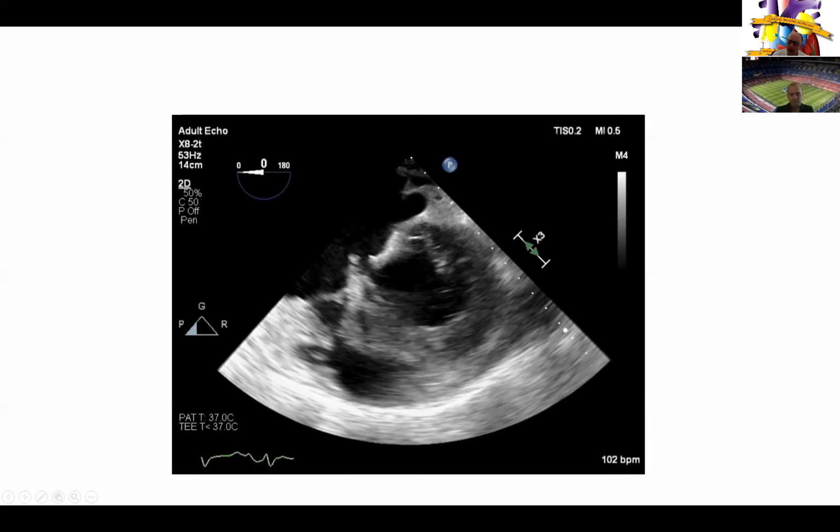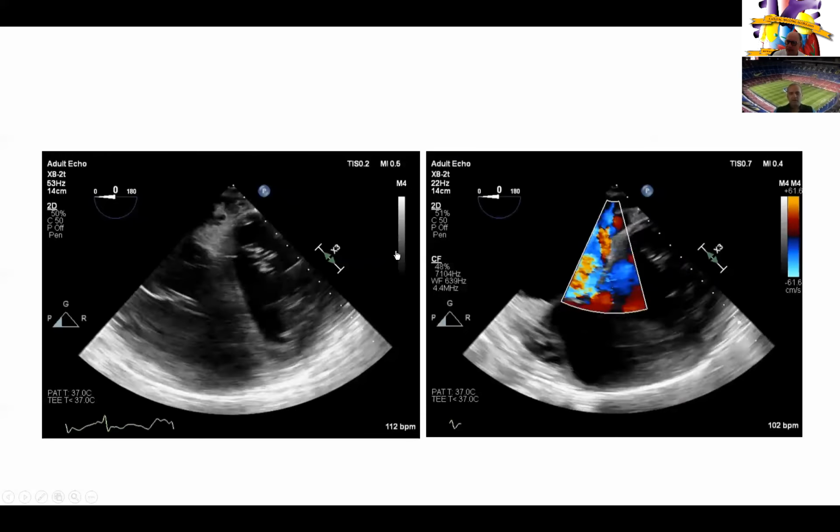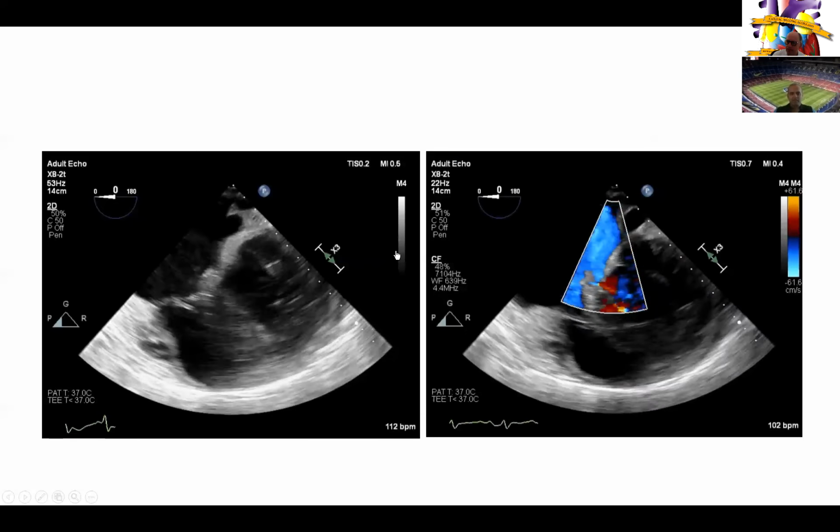Yeah, this is a good view in my mind, just trying to go transesophageal to transgastric. I do it very often, as you will know, for illustration, to see there's the coronary sinus coming right here, the mitral valve in short axis, which is rare to see by transesophageal echo unless you do 3D. And again, you can see that defect tracking from the LVOT with a punch hole here into the right atrium, right where the coronary sinus comes. And you get that nice color right at where the defect is.